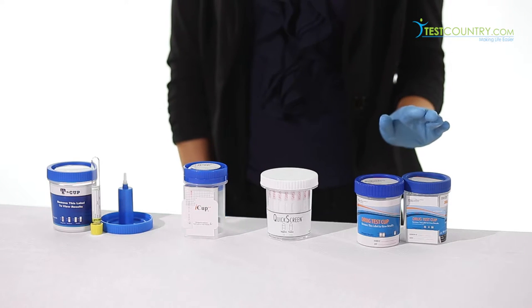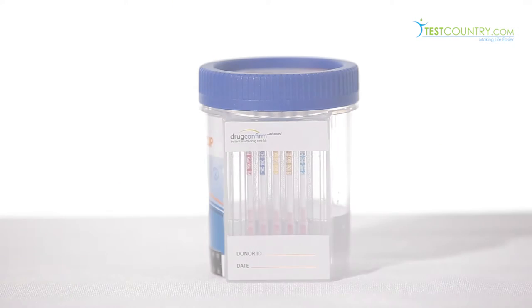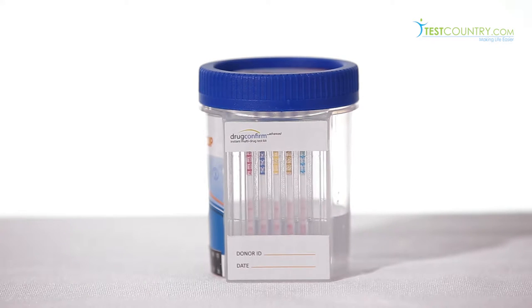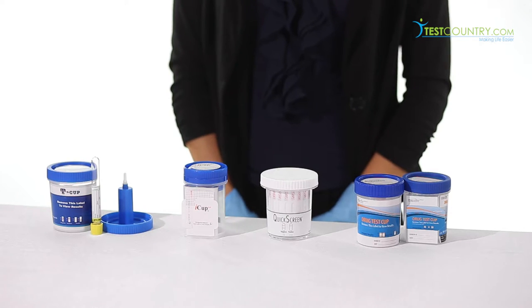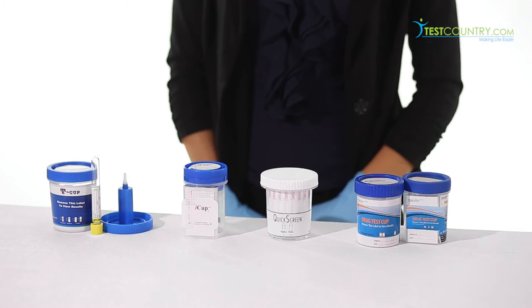Our own Drug Confirm Advanced Cup is fully customizable and can screen for up to 14 drugs in a single test. The cups are also available with the 80-hour ETG alcohol test, synthetic marijuana — also known as K2 Spice — and adulterant testing variations. Drug Confirm Advanced is also available in a flat panel version, which makes photocopying results easy.